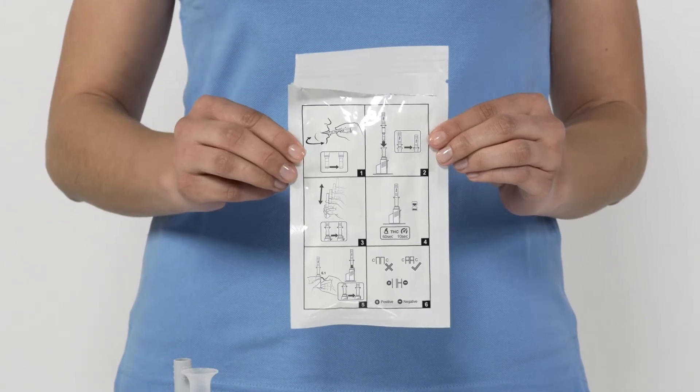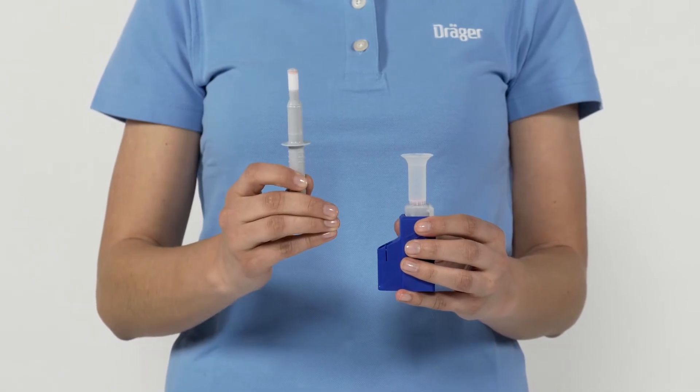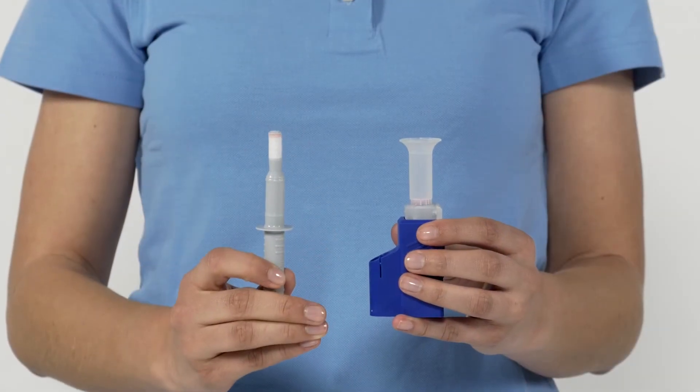The test kit consists of a sampler with a color indicator for collecting a saliva sample, which you take out first, and a test cassette for the analysis.